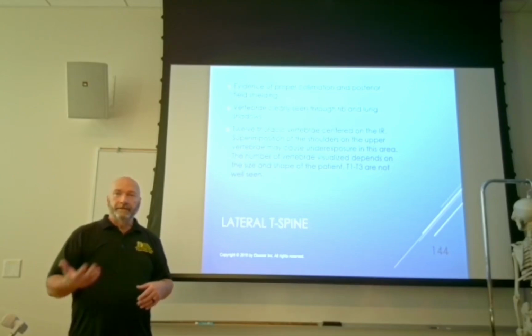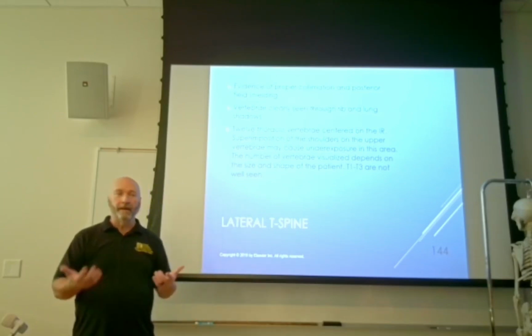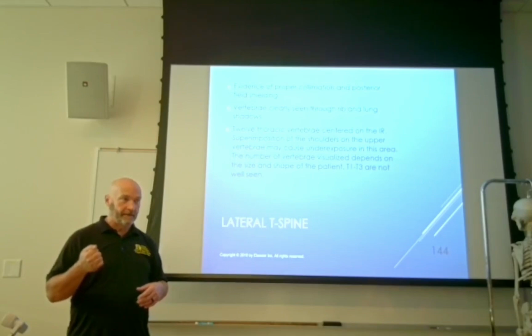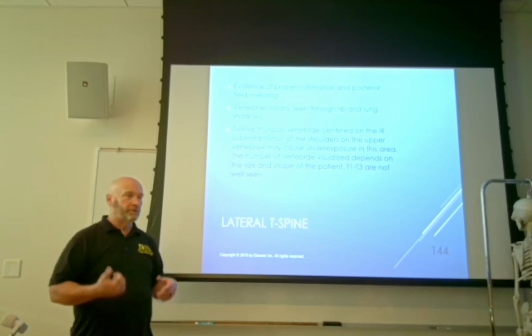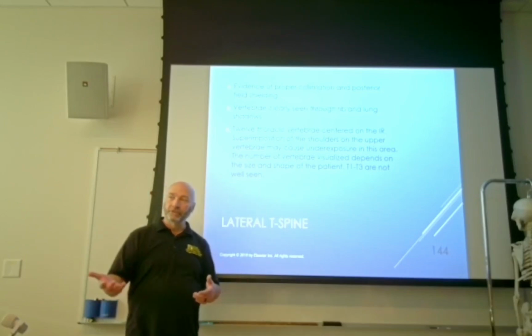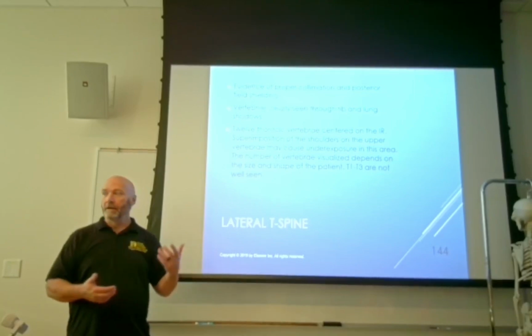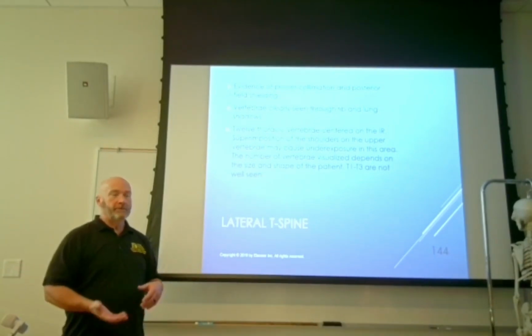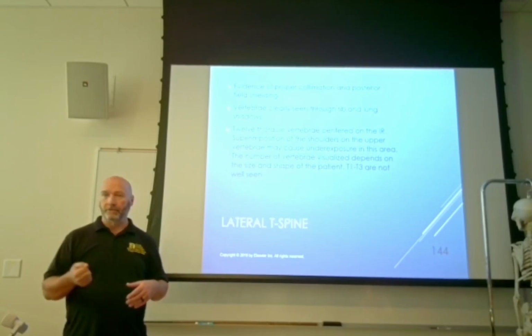Is that going to be enough time to get an adequate breathing technique? Depends on how you go about it, right? So if you make your exposure and the patient is at the end of exhalation, then you're only going to get about half of that movement, right? So what you might need to do, if you're using a breathing technique, maybe you're doing a portable in a trauma situation, a lateral T-spine portable at 100 mAs is going to be a 1-second exposure. So what you may have to do is have the patient take in a deep breath, tell them to slowly blow it out, and while they're blowing it out, make your exposure.